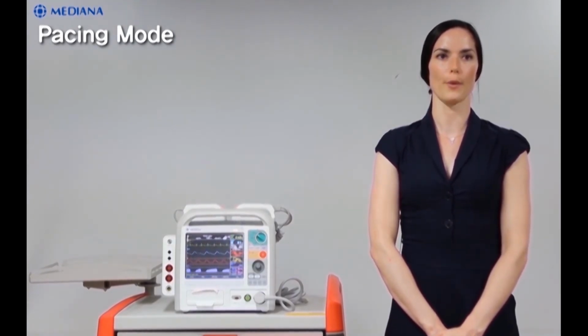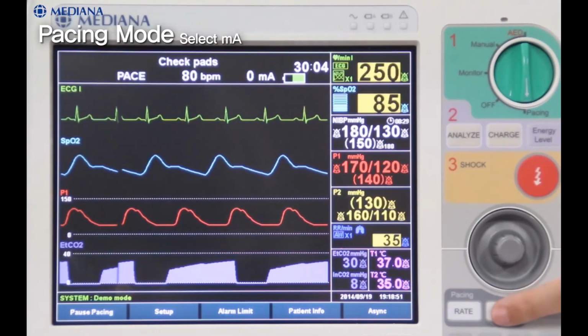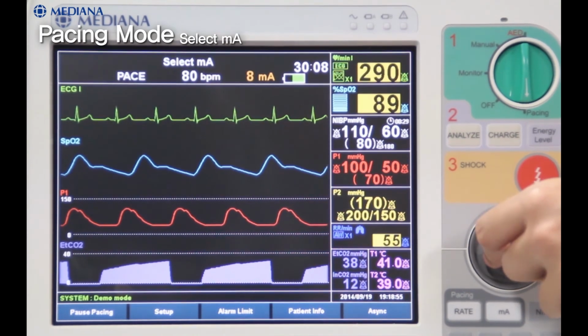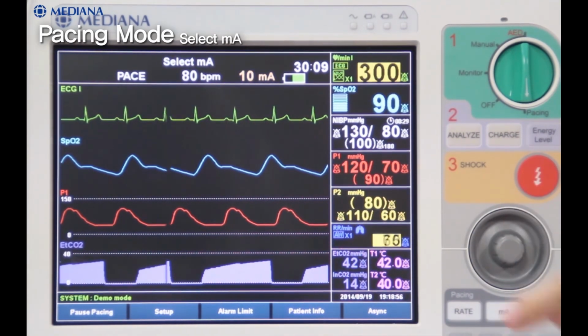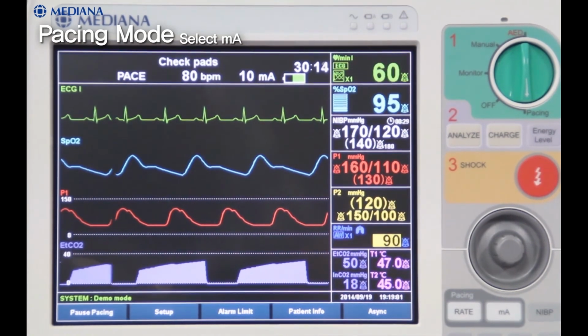When the milliampere button is pressed, the color of the output value is changed and the output value can be modified. The select milliampere message is displayed, and by pressing and rotating the multifunction knob, you select the desired output value. The value is changed by 2 milliampere.